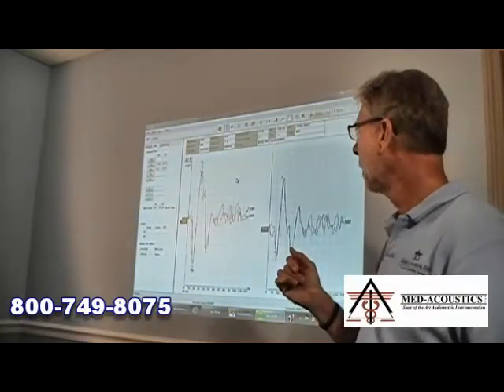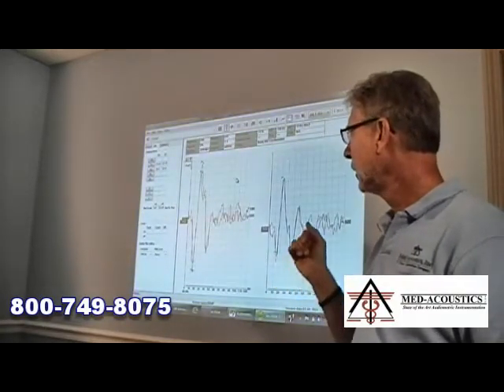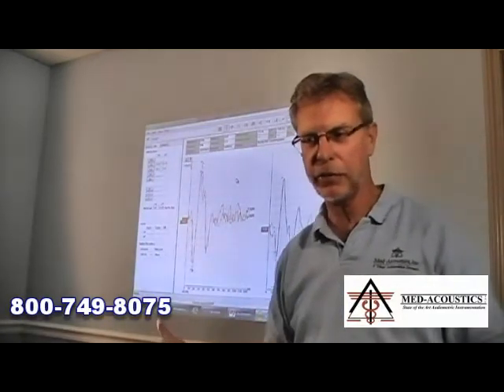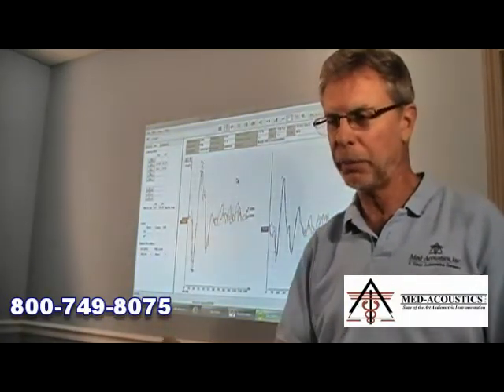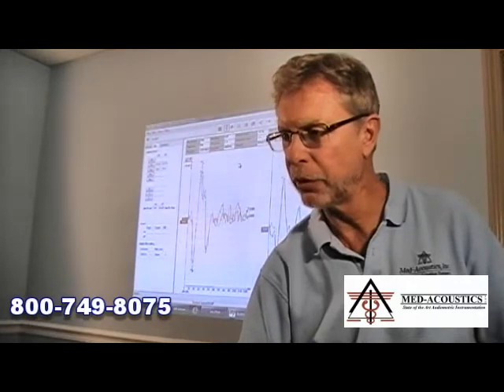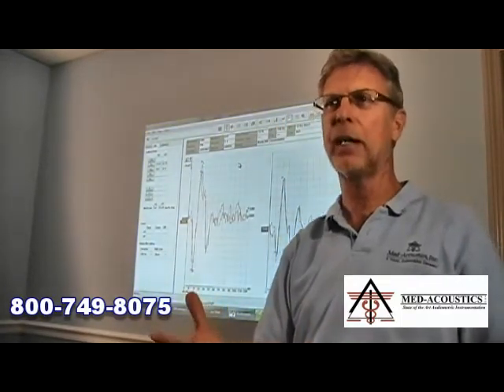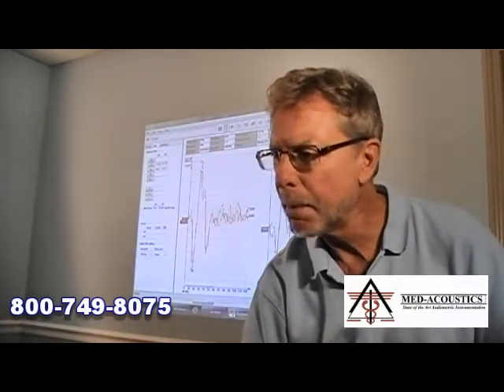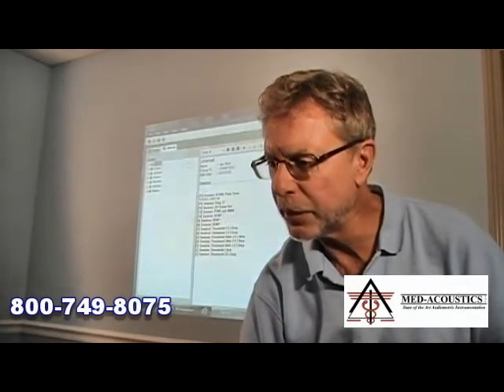And so the VEMP is another test that can be easily implemented on these with no problem at all. We've been doing VEMPs with it quite a bit, and some research on different techniques. And if you want to learn more about VEMPs, we have an entire introductory presentation on VEMPs on the Med-Acoustics website. Okay, let me see if I can show you something else that we did on Jan.